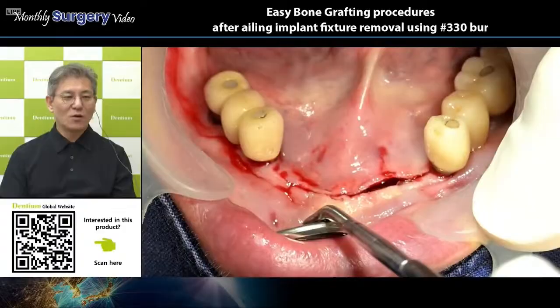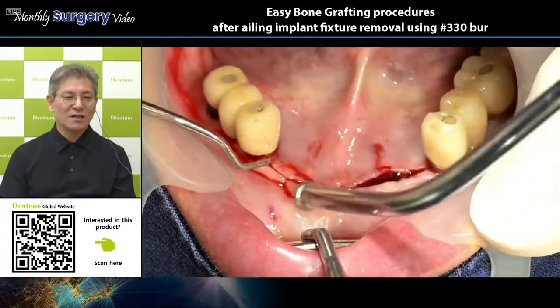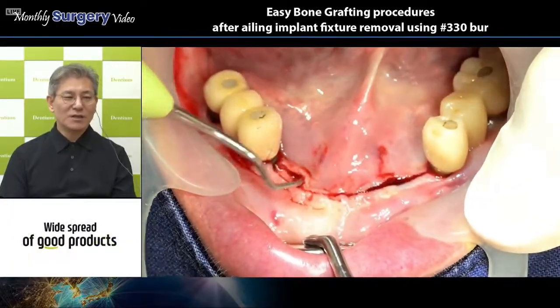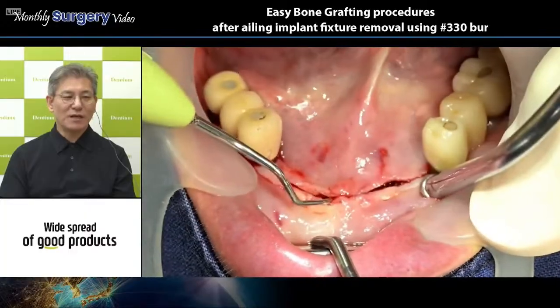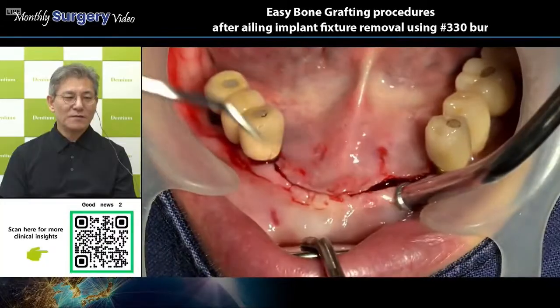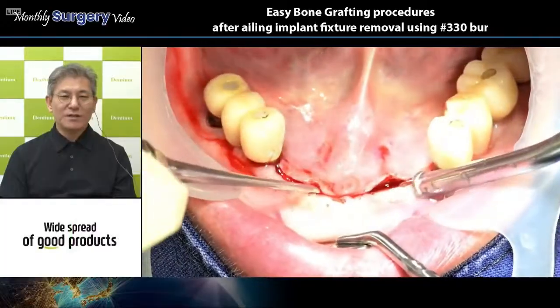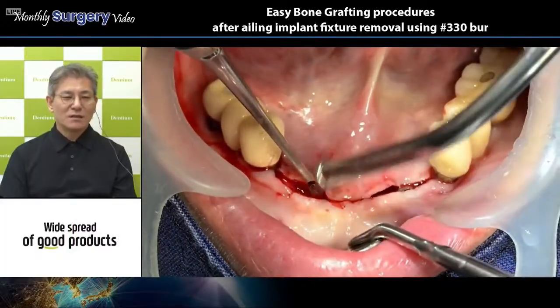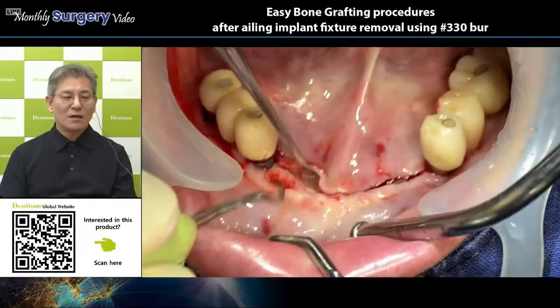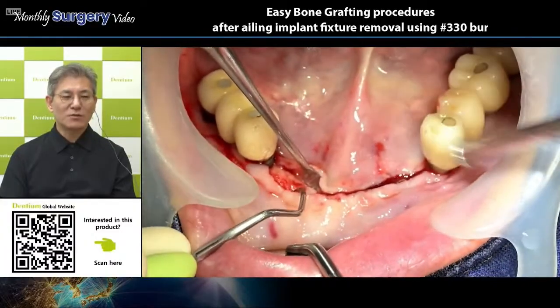However, in the lower jaw, the mandible, the mid-crestal incision is the general scheme. As you can see, the mid-crestal incision was made and the buccal flap and the lingual flap were reflected here. And around number 33, the previously installed implant is exposed, right? With the cover screw.